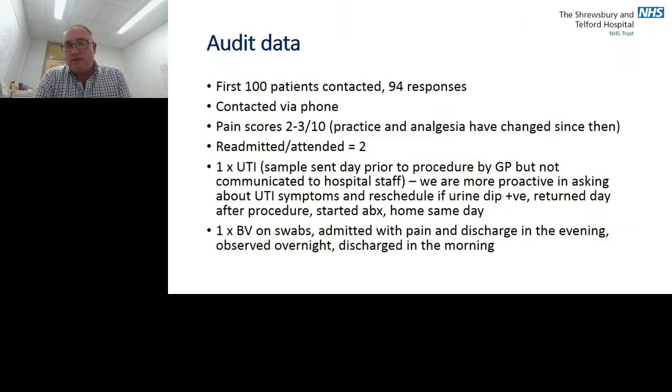From our audit data, initial first 100 patients a few years ago, we had 94 responses and all the patients were contacted via phone. They had pain scores of 2 to 3 out of 10, but note our analgesia has changed slightly since then, so it's improved. We had 2 patients readmitted out of that 100.